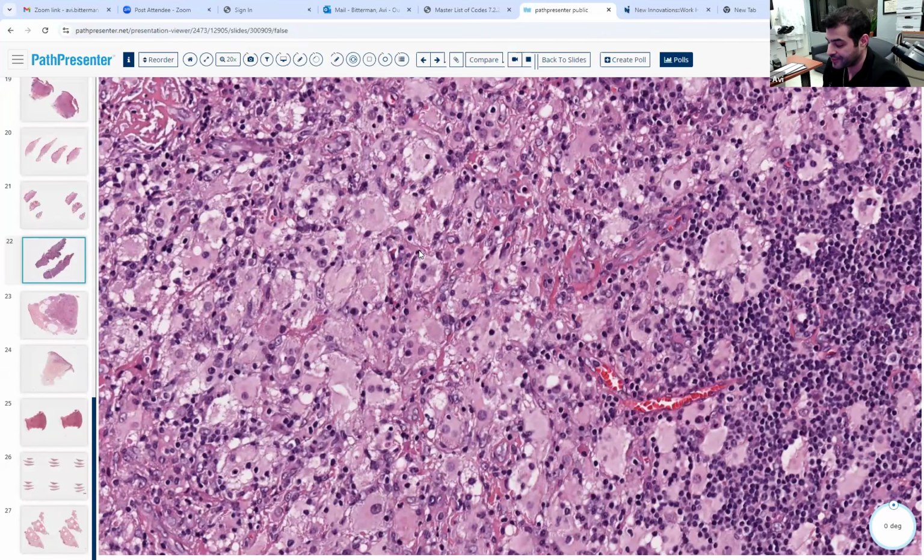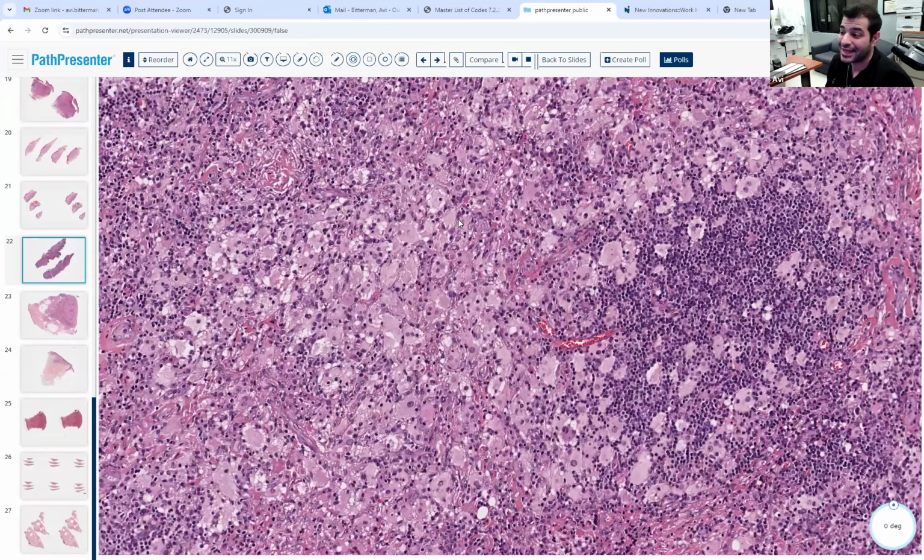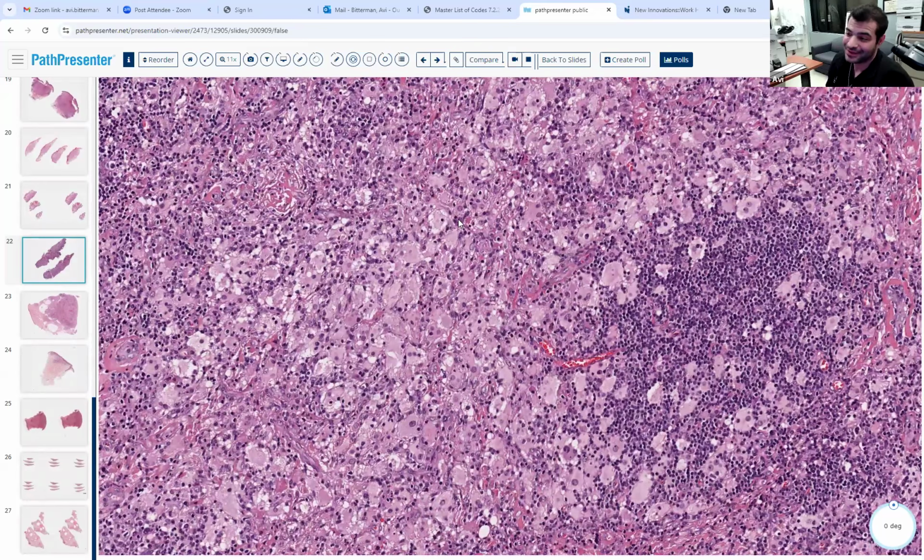Okay, and by the way, indeterminate cell histiocytosis: how's that different in staining from Rosai-Dorfman? Indeterminate cell histiocytosis is positive for CD1a. Very good. Note that this is important because that's fair game, and they test this. Know your histiocytoses, know how they stain.